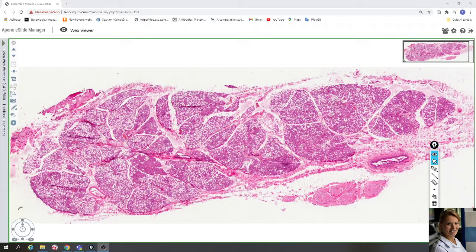In this video we will take a look at the slide of glandula sublingualis. This slide is stained with hematoxylin eosin, which means that nuclei of cells are violet and cytoplasm is pink.